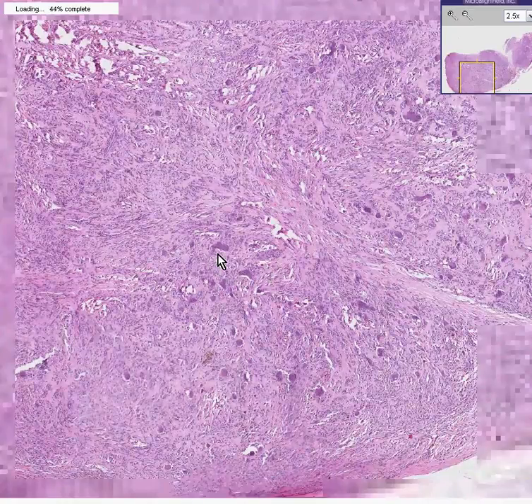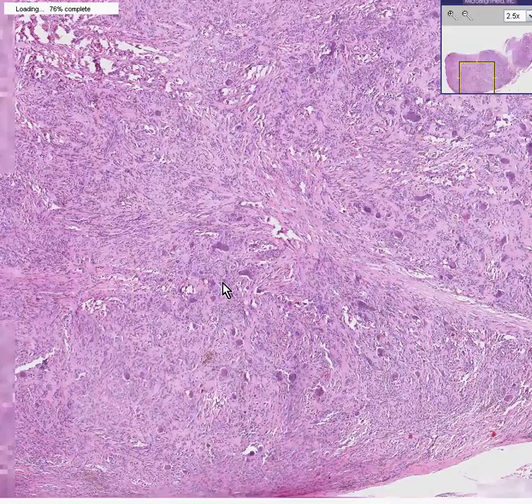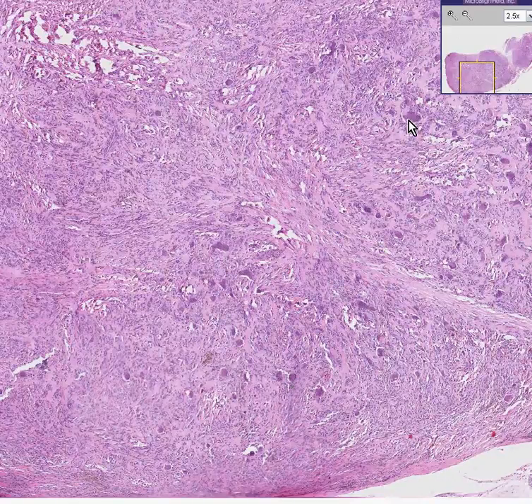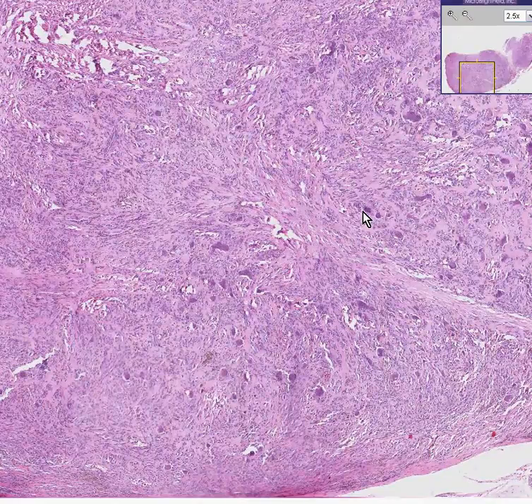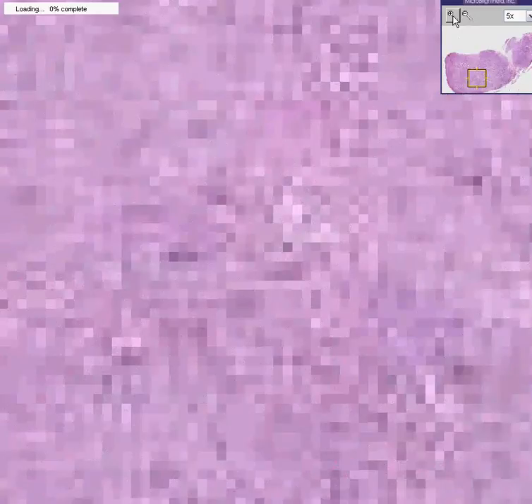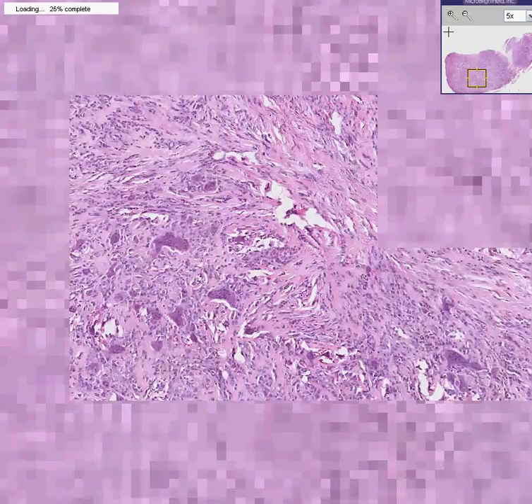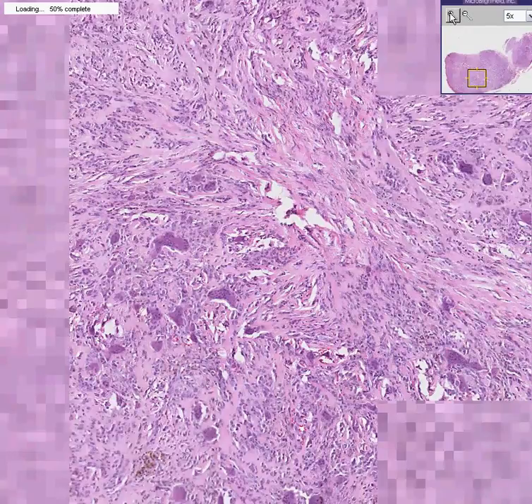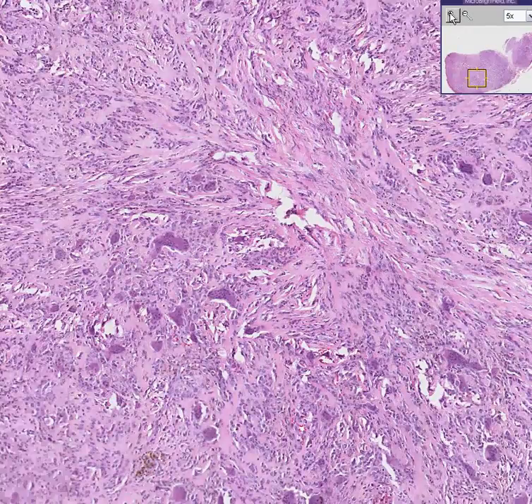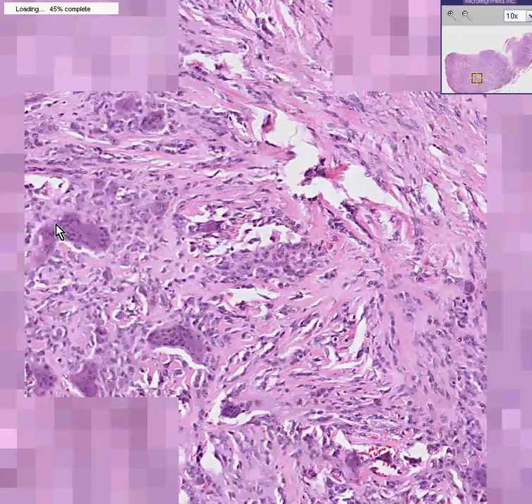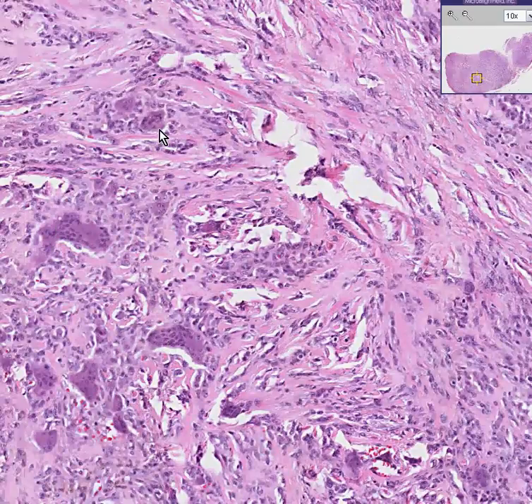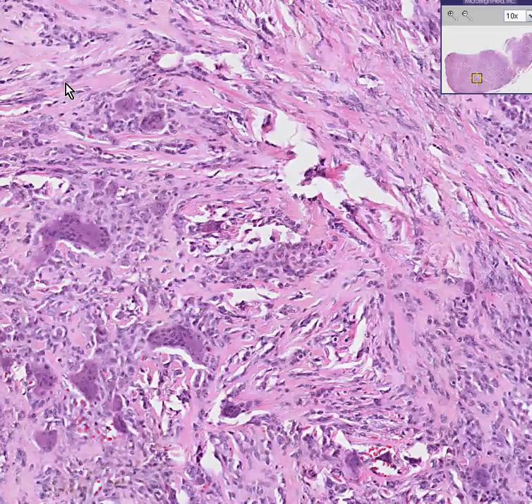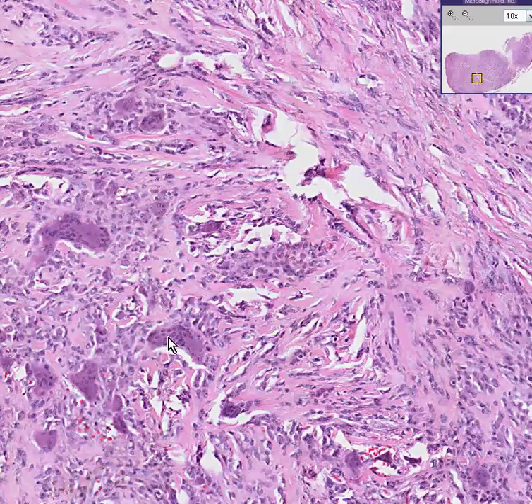They are called giant cells, and you could see even at this power, stippled here, there are certain structures that look quite a bit bigger than the rest of the cells around them. If you were to see these cells in granulomas, you would call them regular old multi-nucleated giant cell histiocytes. And here they are — this one might have 30, 40, 50 nuclei. Here's a bunch in here. So the tumor not only grows as individual cells but it forms these coalesced cells that have the classical appearance of multi-nucleated histiocytes.